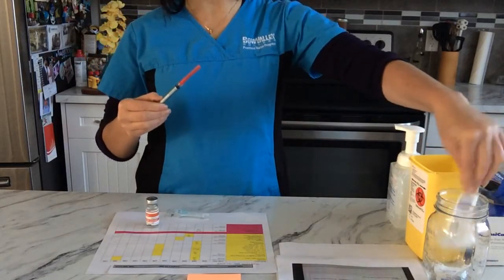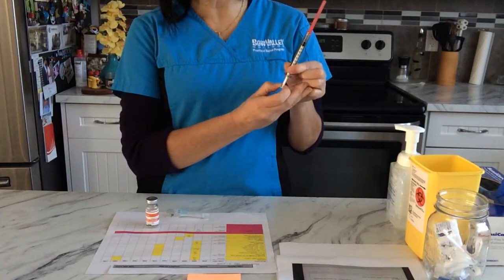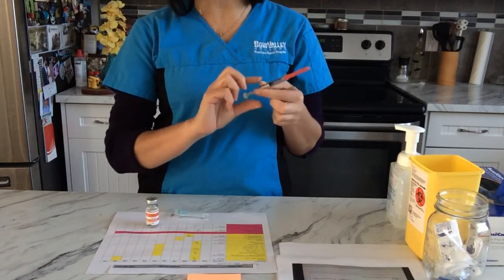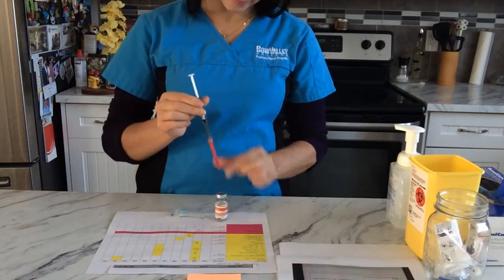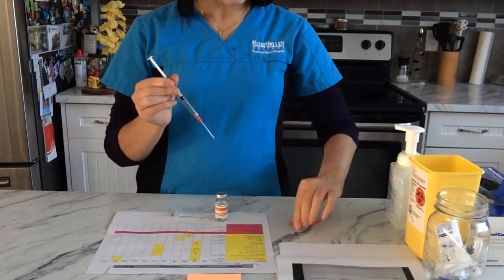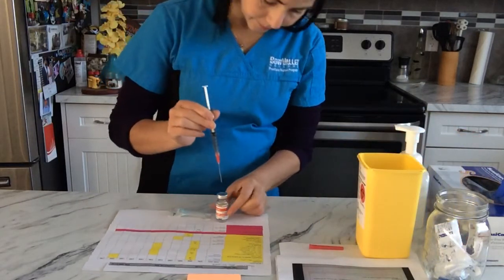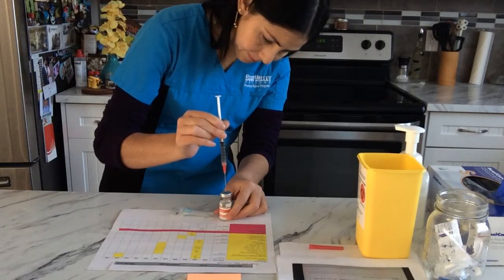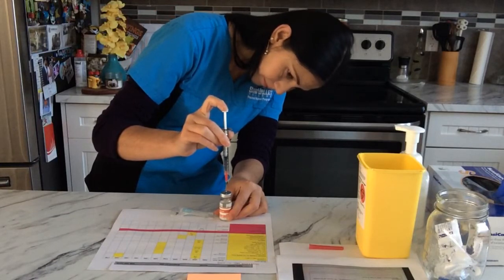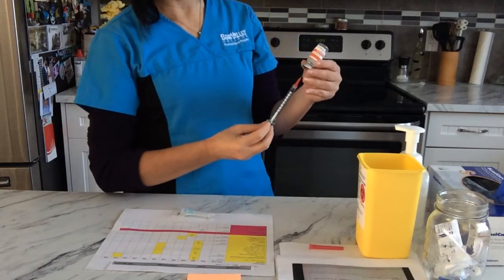Put this in the garbage. And I'm gonna withdraw 0.5 of air. And I'm gonna inject 0.5 of air first. I'm gonna do one hand scoop technique. So we'll put this close by. Now I'm gonna withdraw 0.5.